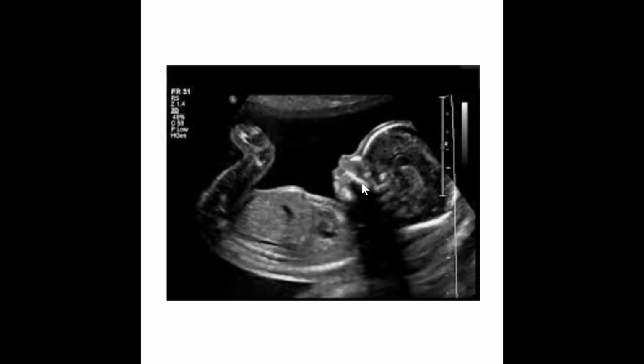Here's another example. As babies get older, their bones get a little bit more calcified and they start to shadow. We don't want to miss the anatomy that's back here, so we'll want to work around it, coming from different angles to avoid coming directly over highly attenuating structures. So again, shadowing behind highly attenuating structures can appear anechoic or just a little bit more hypoechoic.